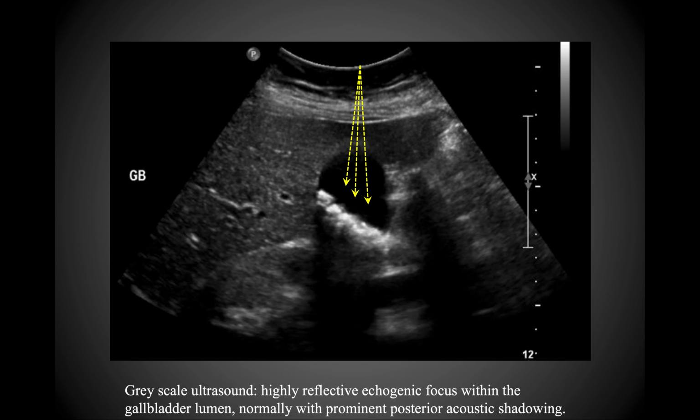And so you can see this is a great example of ultrasound. So this is the gallbladder. You can see the lumen of the gallbladder right here, and then there's a number of stones down here which are echogenic. So you have these highly reflective echogenic gallbladder stones or gallstones. And so what's going to happen here is because they're highly echogenic, you're going to have this shadow that shows up distal to them or behind them, and so we call that acoustic shadowing. And again, that is virtually always indicative of gallstones. Then over here you can see part of the liver as well on this ultrasound.